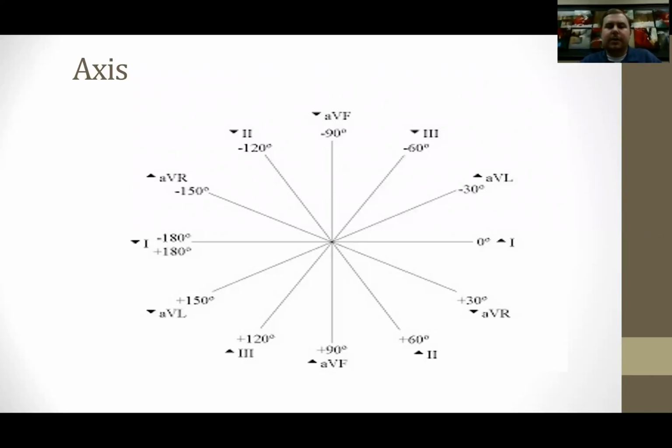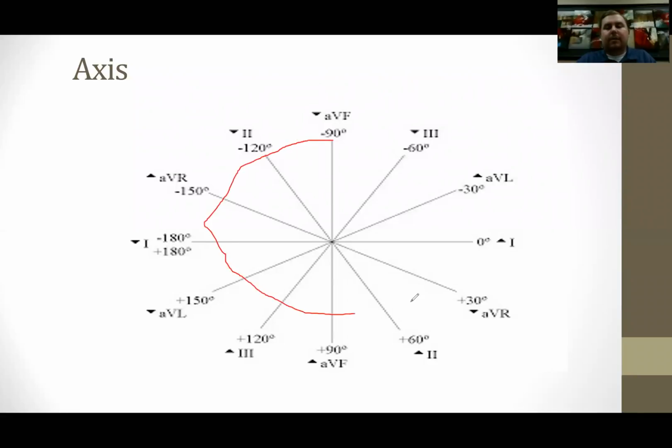So something to do if you don't have axis determination already memorized is to draw this circle. I've probably drawn it 100 something times. Where I'll draw the circle and I'll start off with an X. And from that X, I'll start branching out. So I'll draw my circle, and hopefully it's a lot neater than this. I'll draw my X.